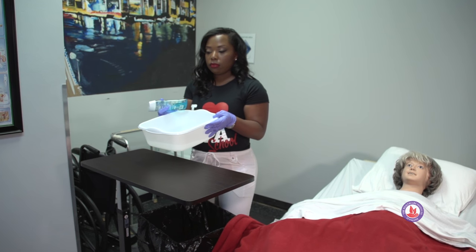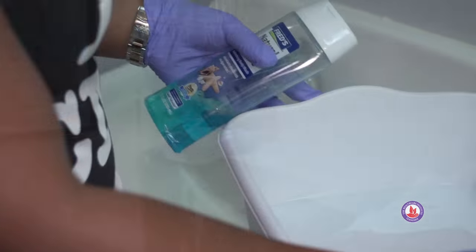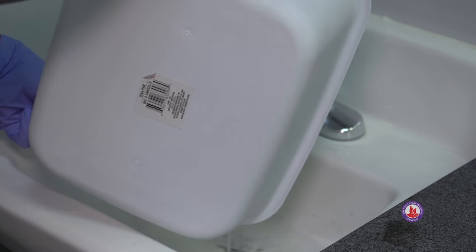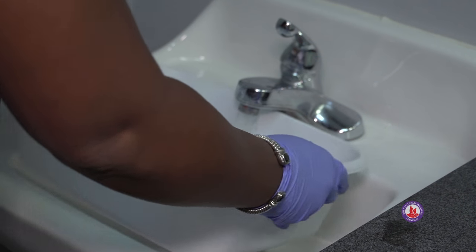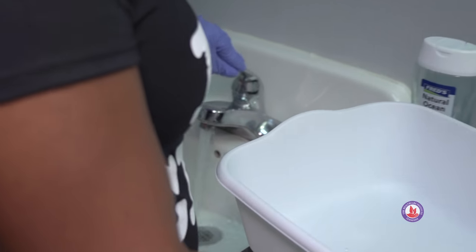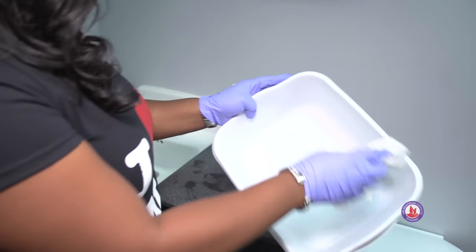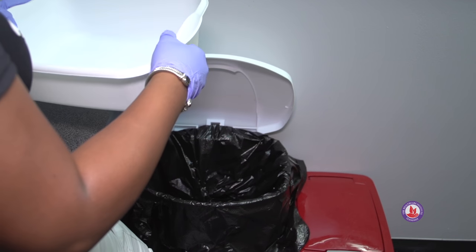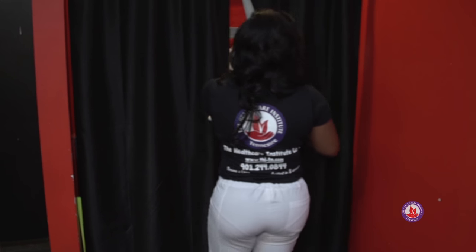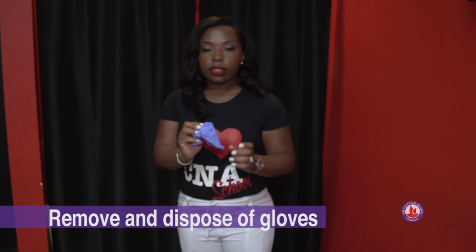We're going to go back to the sink to pour our water out, rinse and dry the container, and then replace our supplies. So I'm rinsing it out, drying my equipment, discarding my paper towel, and replacing it on the shelf. At this point I can take my gloves off and discard them in the trash can.